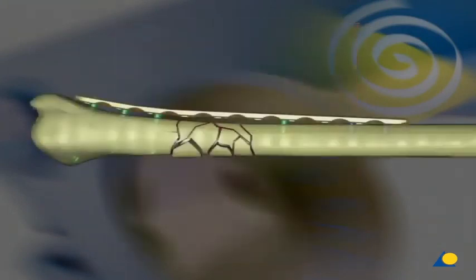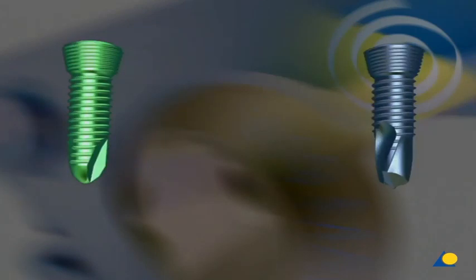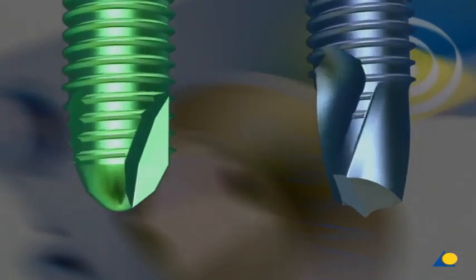Two types of locking head screws are available. The self-tapping locking head screw is used primarily where exact length measurement is required, mainly in the epimetaphysial area; the appropriate drill bit must be used to pre-drill for these screws. The self-drilling, self-tapping locking head screw is used where no length measurement is necessary, mainly in the diaphysial area, and these screws are exclusively inserted monocortically.